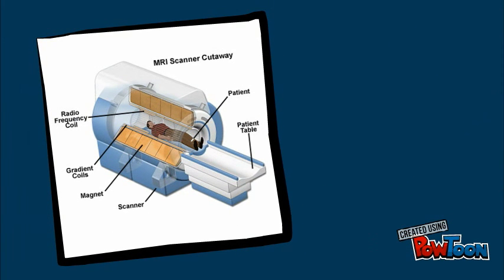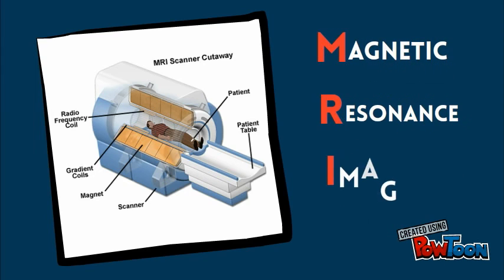So for those of you who don't have backgrounds in healthcare, MRI stands for Magnetic Resonance Imaging. MRIs use magnetic fields and radio waves to create very detailed images of soft tissues, such as organs, and internal body structures.